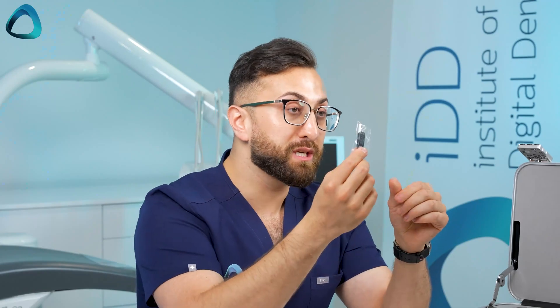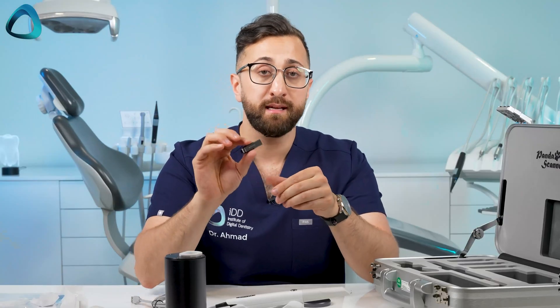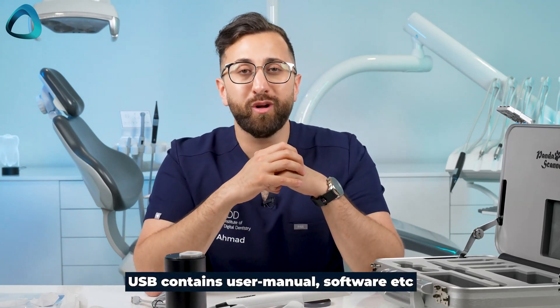And finally, a USB — quite standard in this intraoral scanner market — a SanDisk 16 gigabyte drive with the software on it. And once you've downloaded the software, you can use the drive for whatever you like.